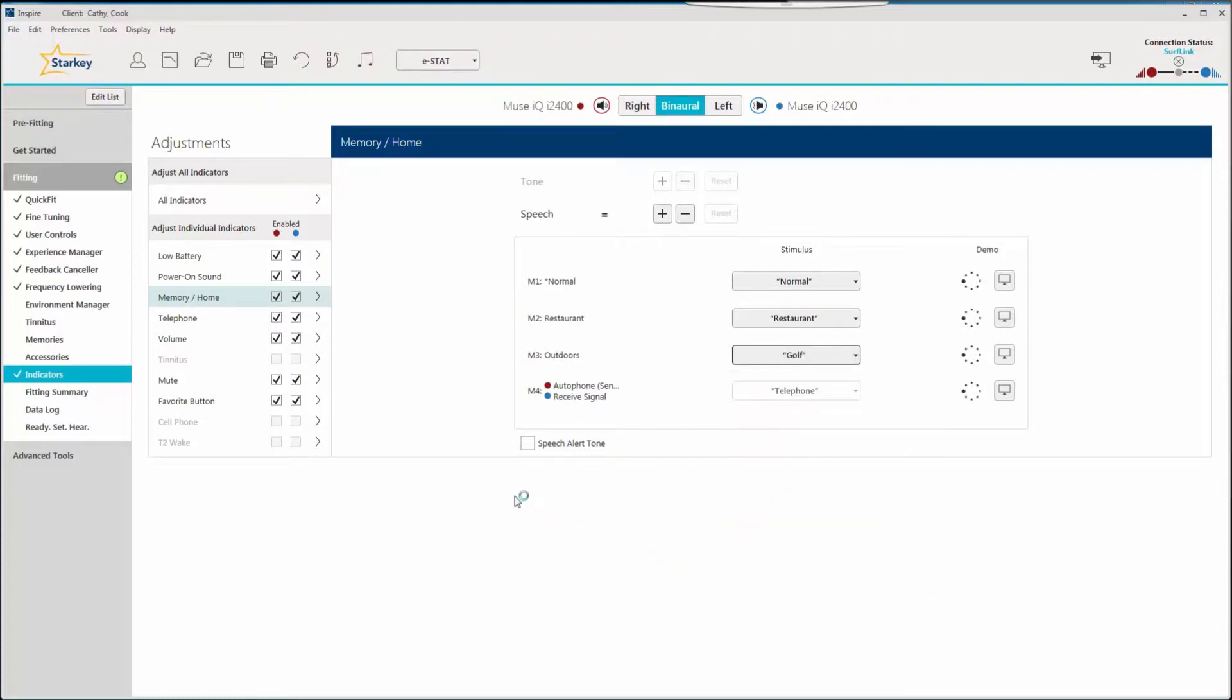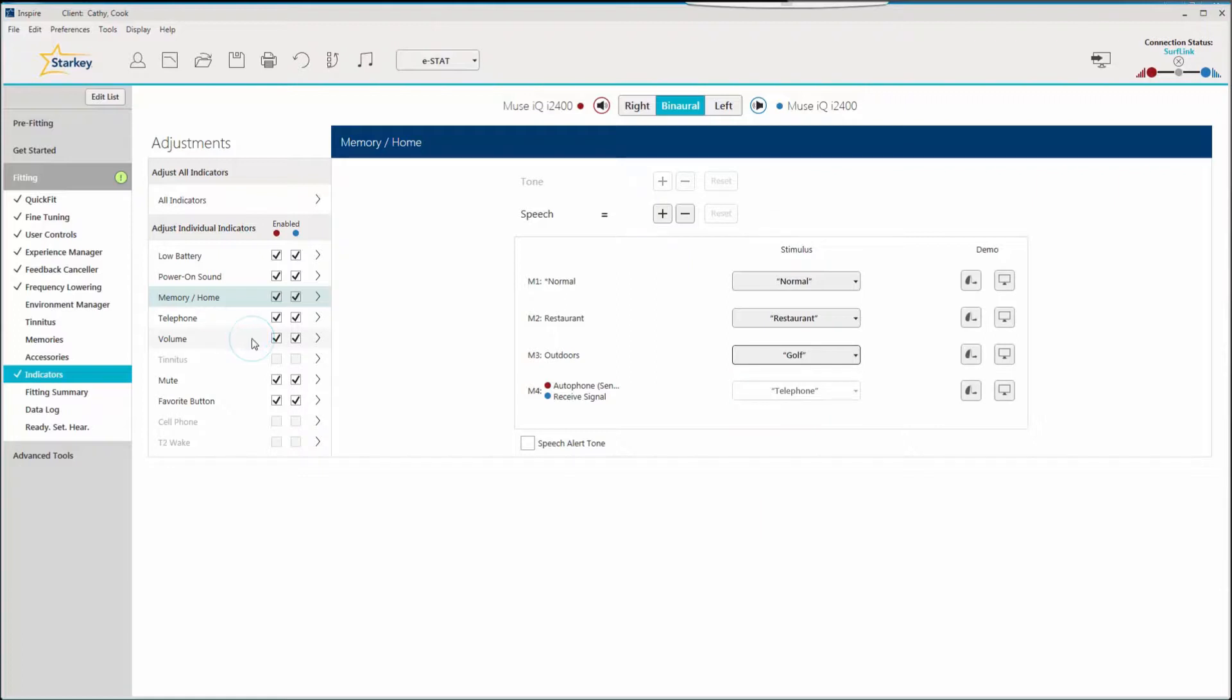Another exciting enhancement with Muse IQ and Salon Synergy IQ products is the flexibility to change the indicator scheme for volume control.